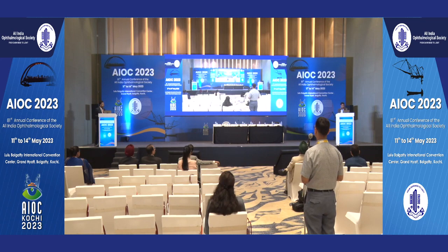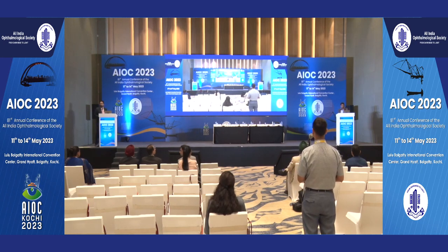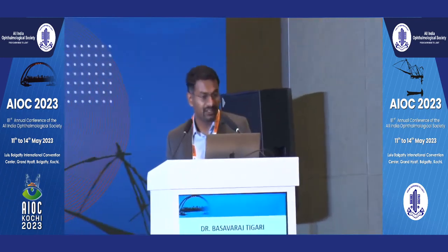Sir, the most caution is that we have to use the minimal possible energy. We have to avoid the fovea, avoid hitting the fovea. The most dependent part depends on the foveal location and the blood location. It should be reserved for at least a 3 disc diameter, more than 3 disc diameter subhyaloid bleed. The third option is, sir, we have to try in other areas with patient head posture adjustment. Because of that, we can avoid these foveal related complications. The ERM and other complications are not in our hands, but at least this complication we would have prevented if we use a little bit of precautions.